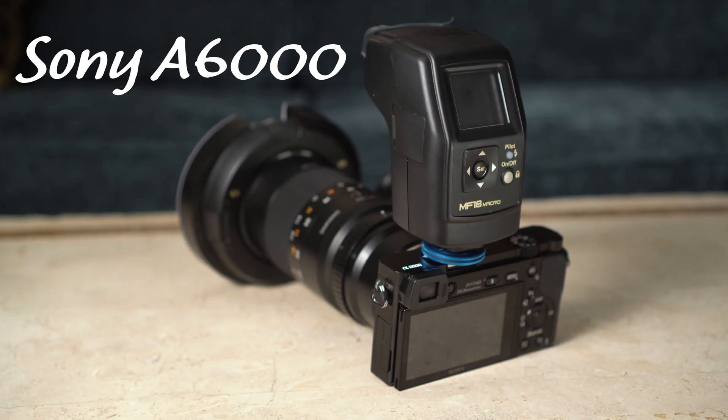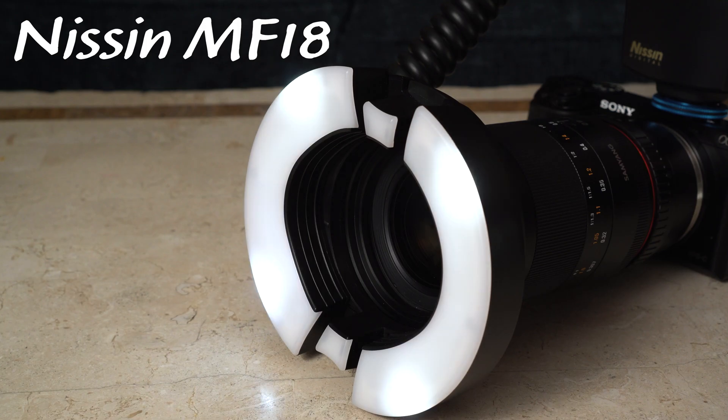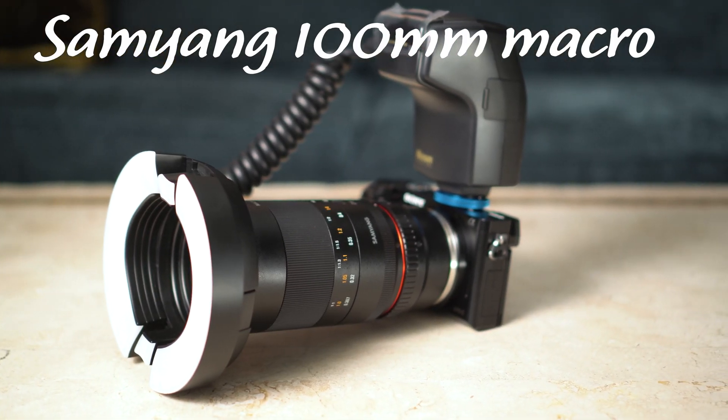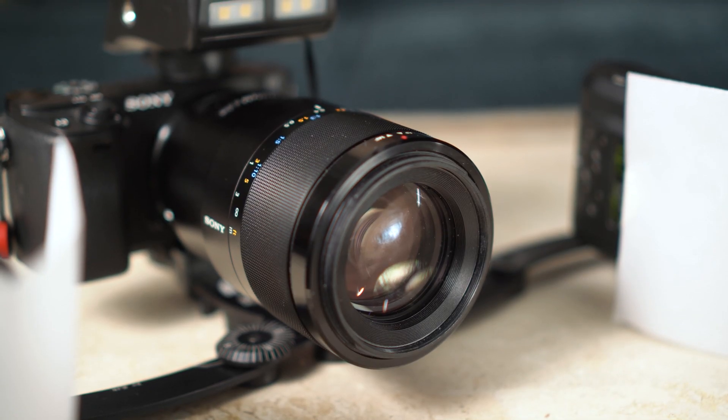Here we have the two different setups — this is the budget setup and this is the more advanced and more expensive one. I call it budget but it's just the cheaper option in the mirrorless world, and it's still more expensive than DSLRs. With this setup you have a Sony a6000 body with a Nissin MF-18 ring flash, and for the lens I've gone for a Samyang 100mm macro lens, which is actually half the price of the Sony lens on the other setup.